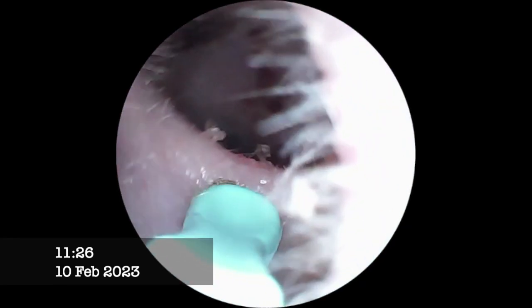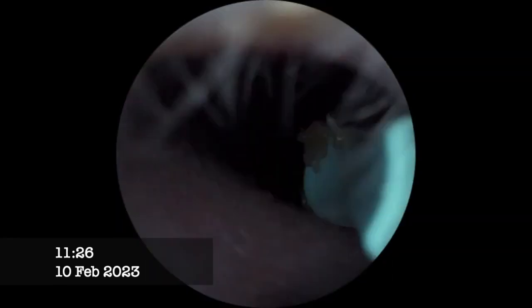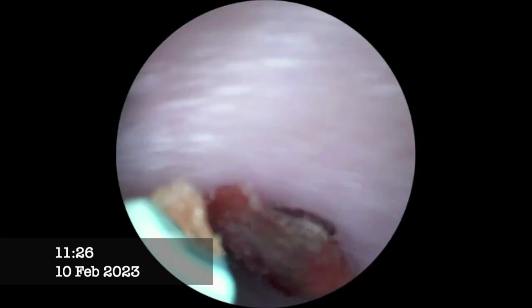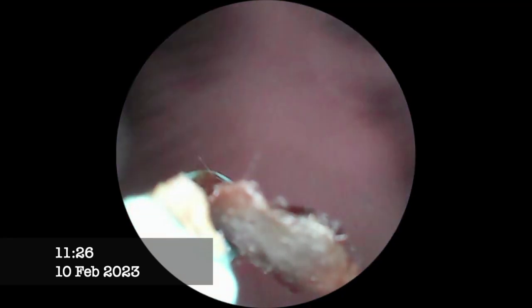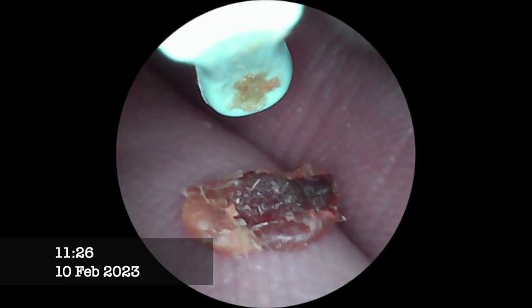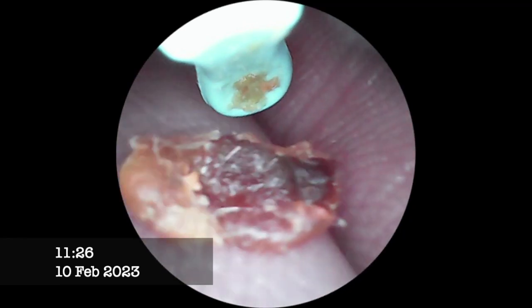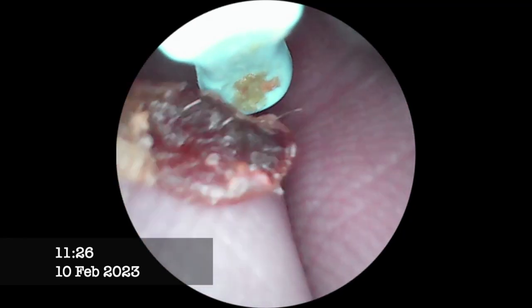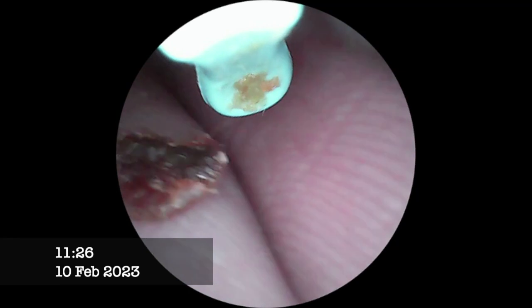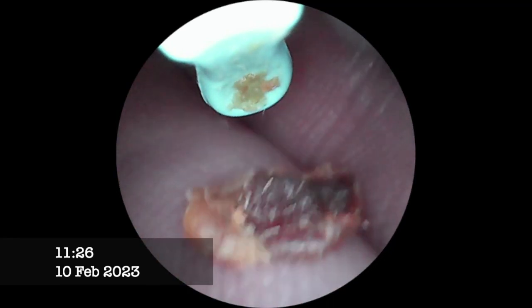After getting it set up with my smartphone, I let Heather go ahead and give it a try. I would be afraid that somebody would hurt themselves, because I'm trying to go in carefully. And this is not easy at all. When I'm pulling earwax out, I use a speculum. Look at the little amount. I know, it's like nothing. It is a tiny amount to try to get that out.